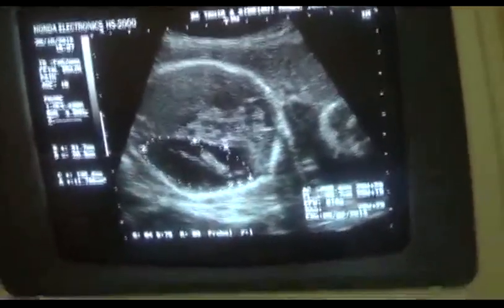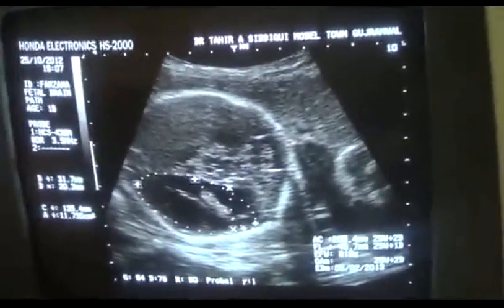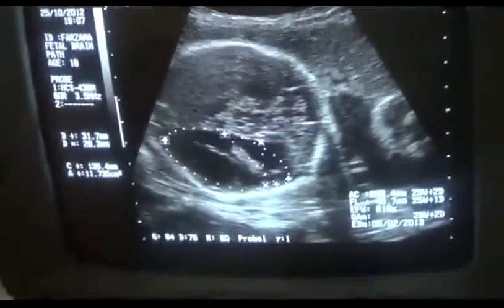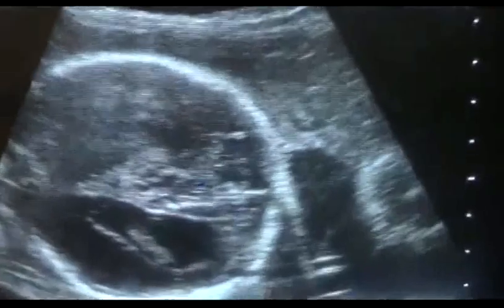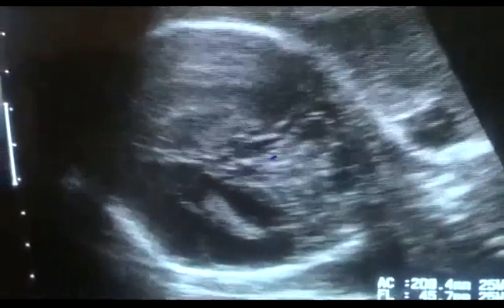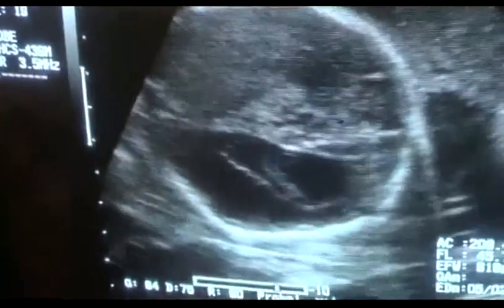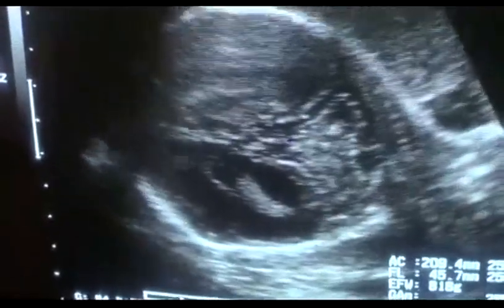And the polyhydramnios was putting a lot of pressure on the ureters, and that was the reason that both kidneys of the mother were showing minimal to moderate hydronephrosis, and she was in severe pain because of severe pressure on the ureters, thus giving a bilateral obstructive uropathy appearance, and the cause of agony of backache and severe abdominal pain to the mother.